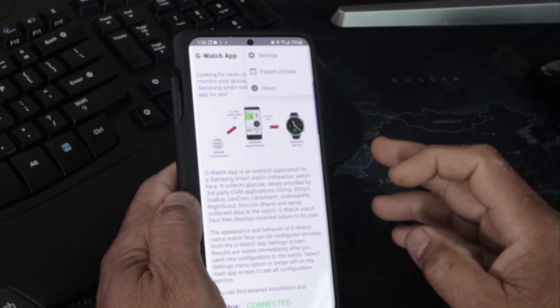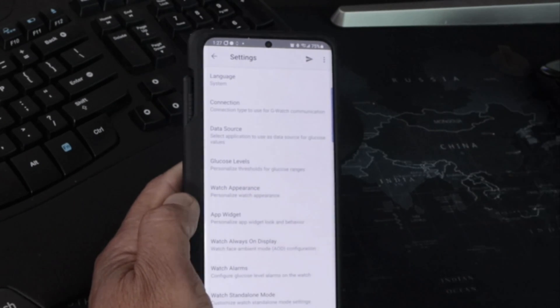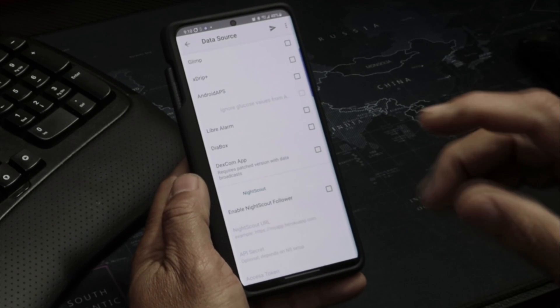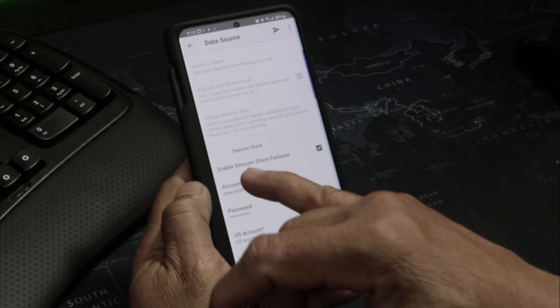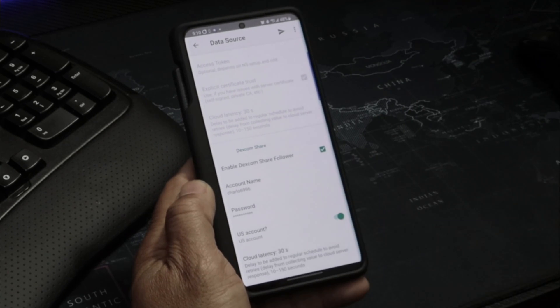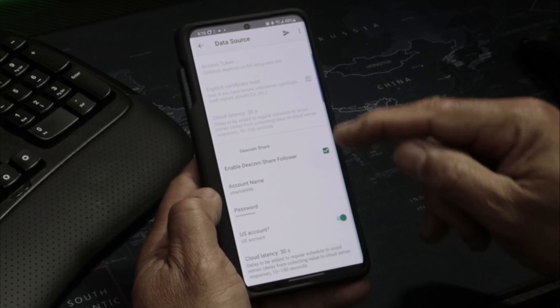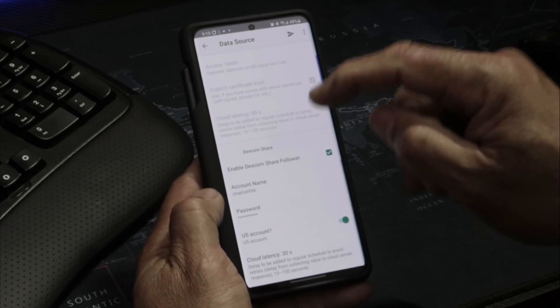Next, go into settings by tapping the three bars at the top. Go into Settings, then Data Source. I'm using the Dexcom app, so I scroll all the way down, enable Dexcom Share, and enter my account name and password. Make sure you have the correct credentials — otherwise it will not work.